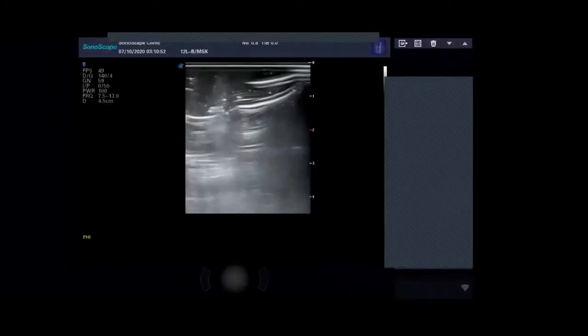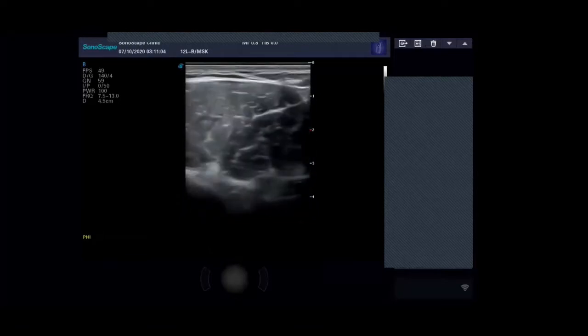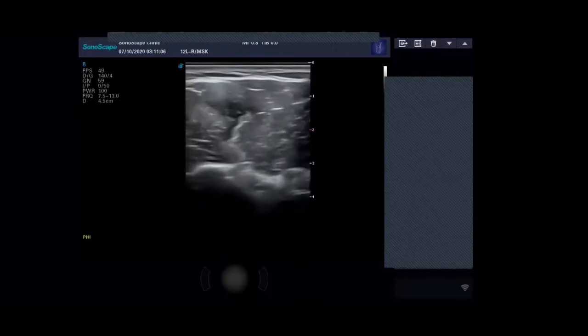Don't want any impingement if you get out there, isn't it? Yeah, exactly. So if you only do one or two, then it's okay to scan from the front and the side and scan from behind the patient. Right, okay, so what I do is I'll look, first of all, at the biceps tendon.